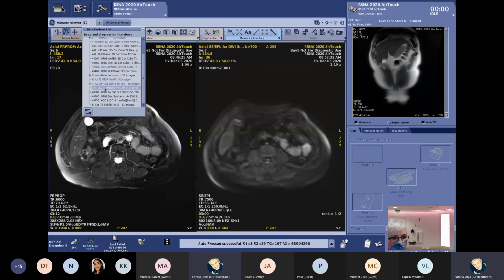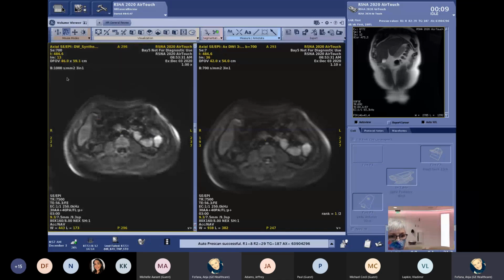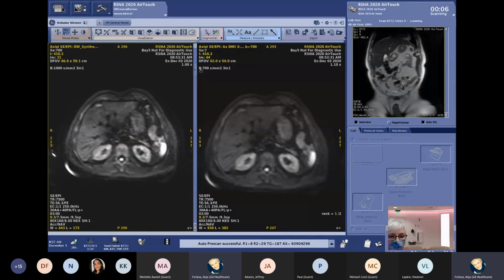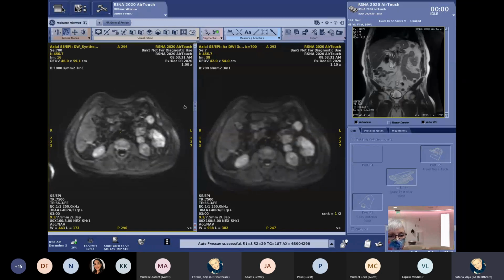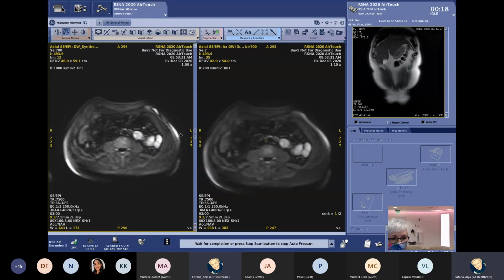And then I can just launch and go ahead and show you the synthesized data as well. So here, remember, we picked in the protocol a high B value of 1000. You can see that here, that we now have a 1000 B value as well. And this one is the one which has been calculated, so it has not been scanned. That technique we call MAGIC DWI has a lot of value everywhere in the body where you want to have high B values, but you don't want to scan them, and you want to save some time.